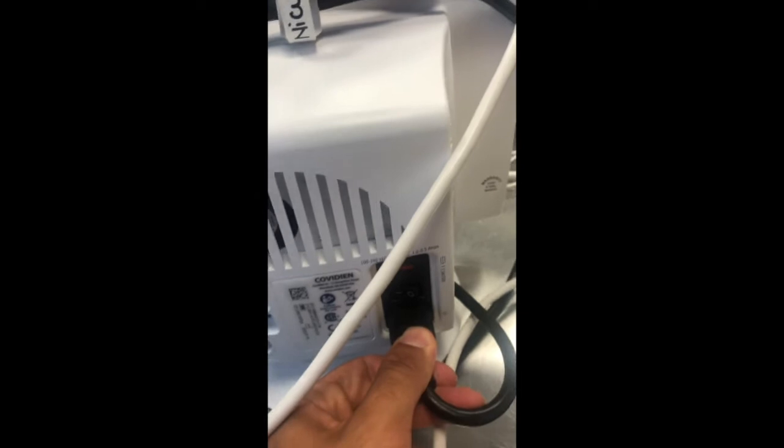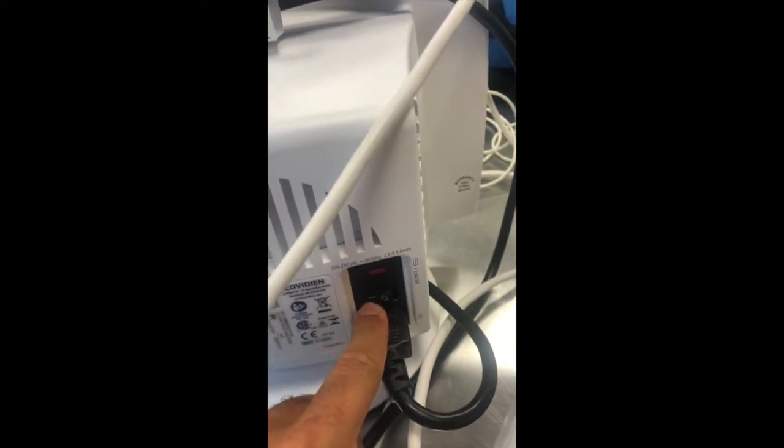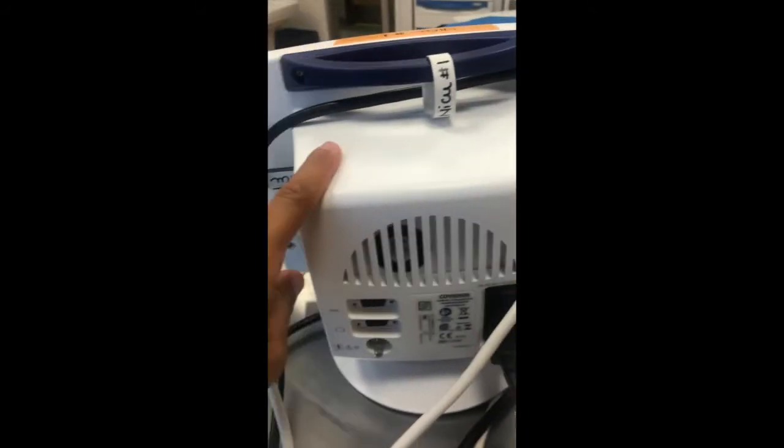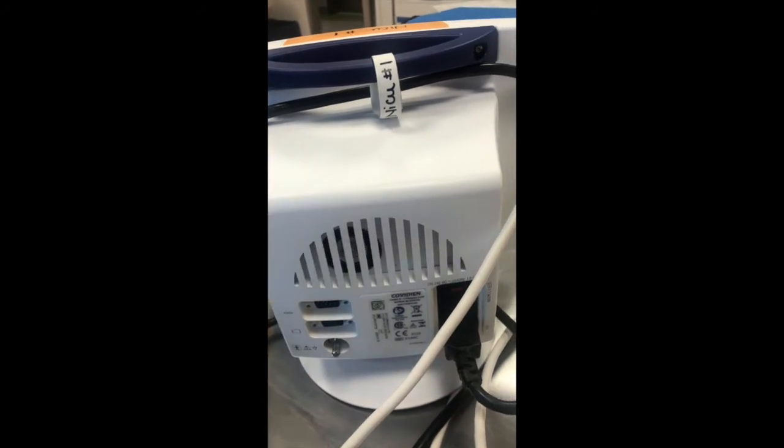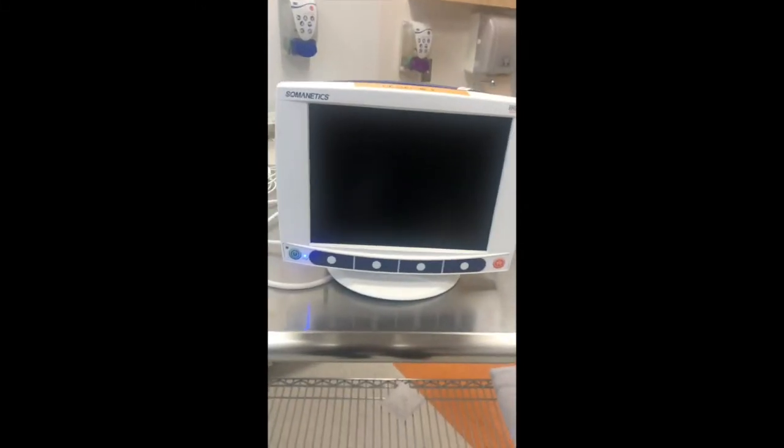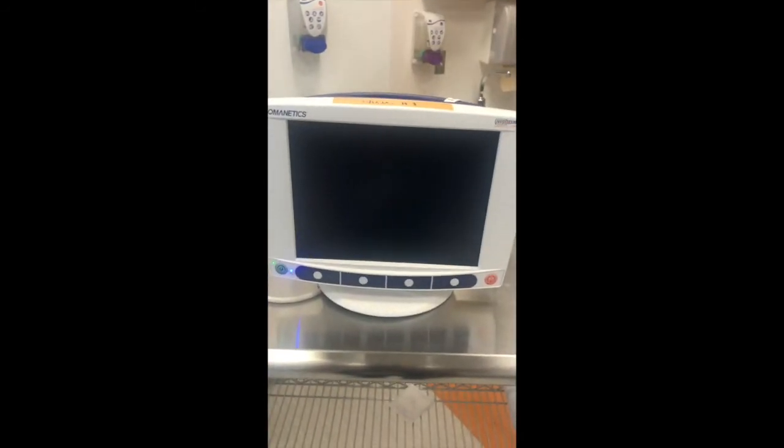Make sure that your monitor is well plugged and that the switch is set to 'I,' meaning on, so the machine runs on the plug rather than on battery. Whenever the monitor is plugged to the wall, you will see a blue light. If the blue light is not on, it means it is on battery mode, which we don't want. To turn it on, press the power button and the monitor will start lighting up.